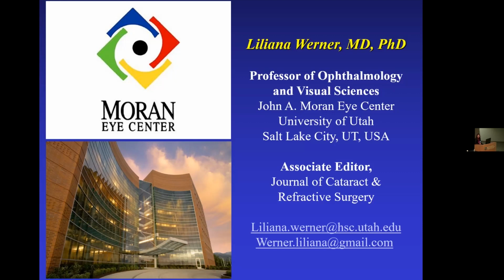And in terms of hydrophilic acrylic lenses, this is always a question that I get: should they be abandoned? It is difficult to answer, because in our laboratory, we see these complications every day in large numbers. But when you try to really get the rate of these complications, they are not so high. It's less than 1%. Of course, we see this all the time. But on the other hand, that 1% will require explantation. So if you have a patient with an eye that's already complicated and now you have to do an explantation procedure, 1% is even too much.